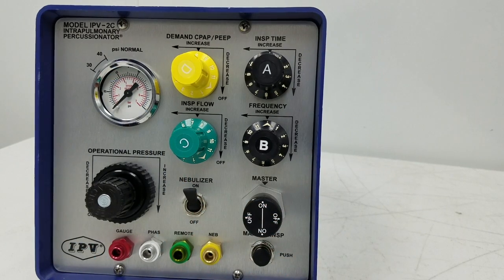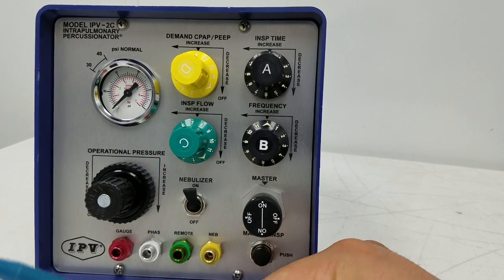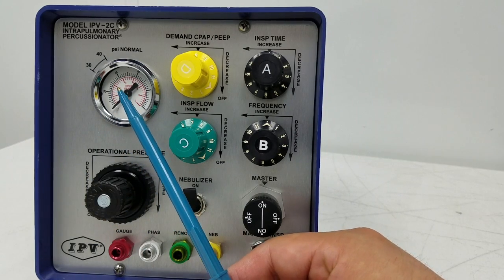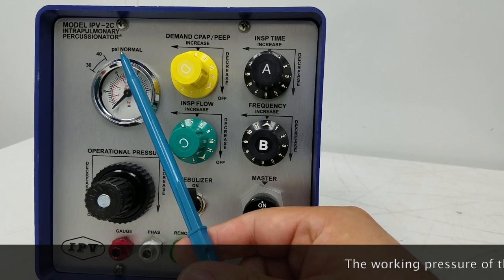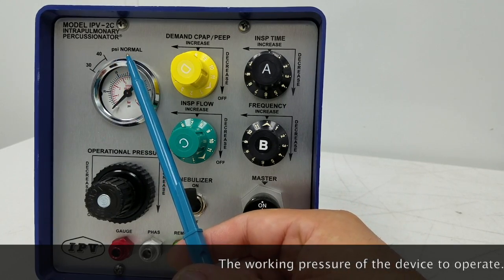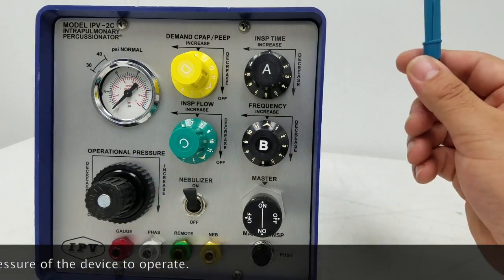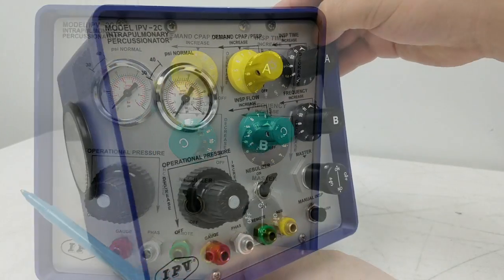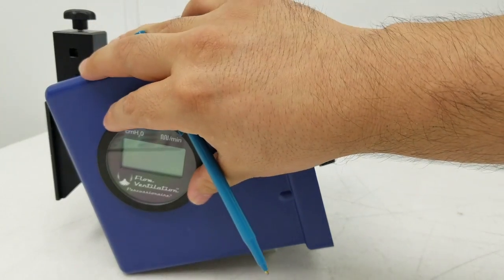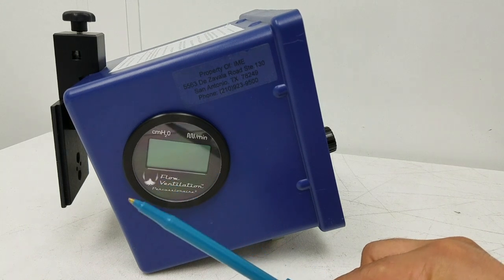This is actually going to control the operational pressure, which we're going to have set at 40 psi. I've talked to many doctors and even therapists and they tend to believe that this is actually the pressure being applied on the patient — it is not. It's psi, pounds per square inch; it's what's being converted for this machine to work from your 50 psi source and this is regulating it. How you find out the pressure being applied on the patient is going to be on the side of the machine.